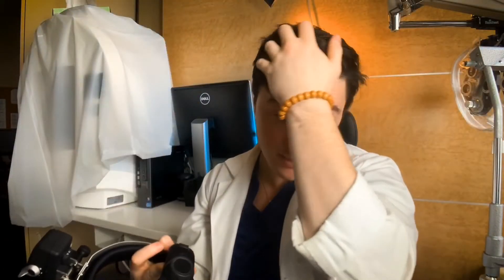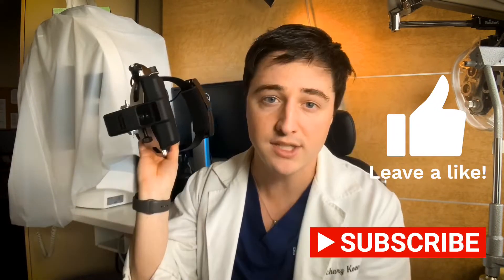So what this is is an indirect ophthalmoscope. You've probably seen it before — you see an ophthalmologist wearing it. I'm assuming that if you're watching this channel, you are maybe new to ophthalmology, maybe you're a medical student about to do an away rotation, or you're starting ophthalmology residency and wondering how to use it. So let's go into how to use this, the ins and outs of all the buttons, knobs, and things.